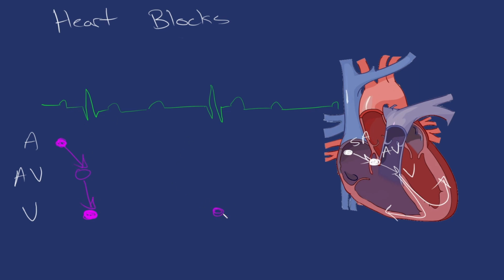Then this next one here, okay, it's that same kind of issue we saw before, right? It's hanging on to it a long time, longer than it's supposed to. And then finally what happens is the SA node goes off, but there's no ventricular firing. Actually, it goes to the SA node again, and this would continue. So this is called our second degree. This is a type 1. Okay, second degree type 1 AV block, also called the Wenckebach.